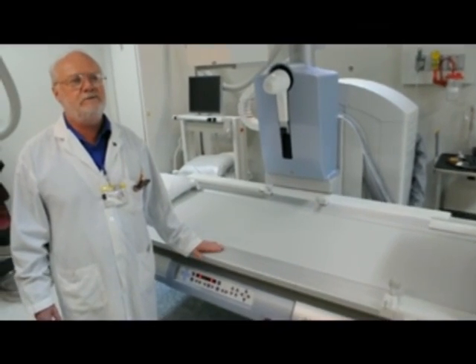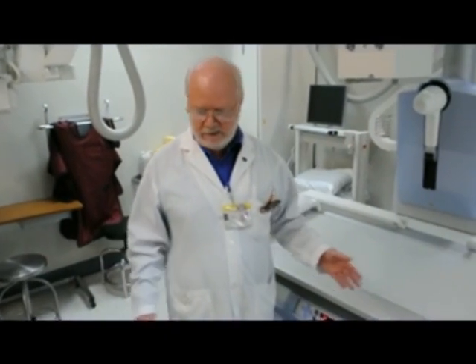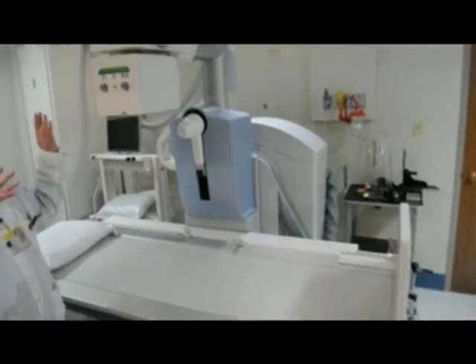The old machine that was in here was actually 20 years old. So we had to start back in June, take the entire unit out, redo the room. And as you can see, it's a fabulous job — all new flooring, all new lighting, all new ceilings, all new ventilation.